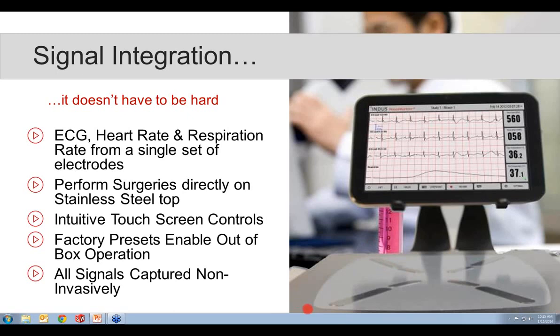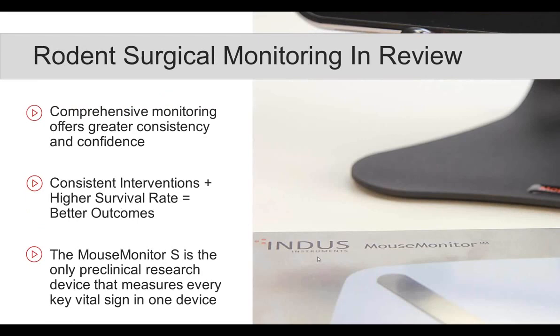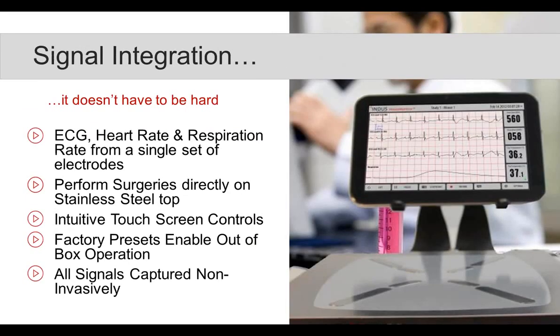There's also a set of electrodes here on the front of the device that allow you to do external ECG electrodes. So you can do many different types of electrode placement techniques for side entry surgeries. There's also a multiplexer available inside so that the orientation of the animal can be done in many different ways.